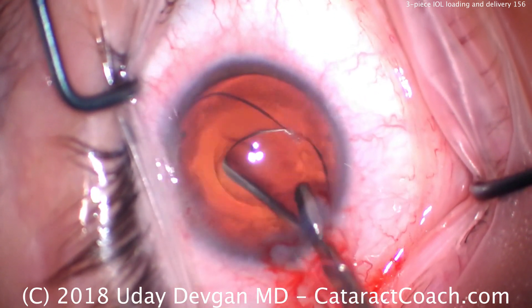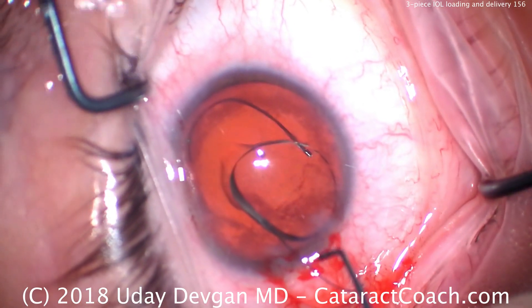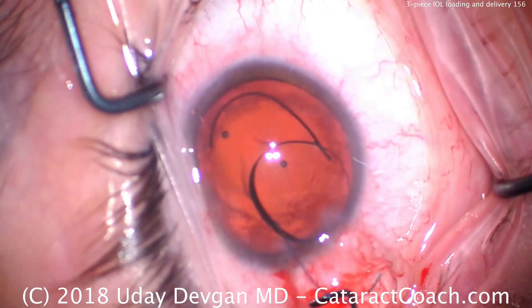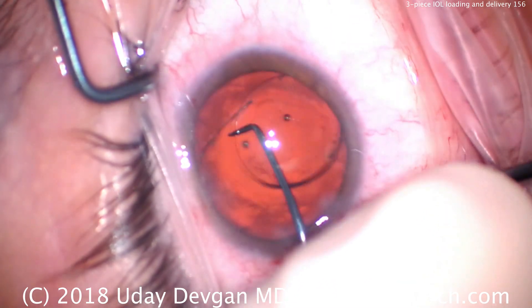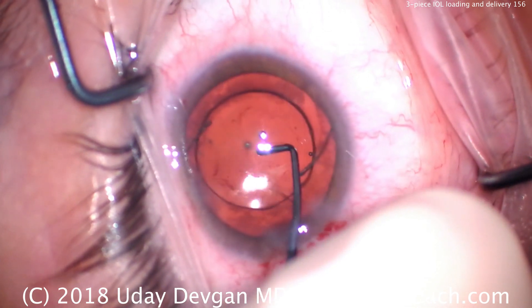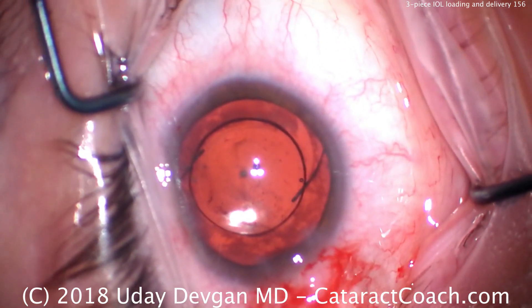We twist it to get the rest of the optic out, and now we can get the trailing haptic in as well. Importantly, we're confirming that the lens is in the eye correctly in the anti-S configuration. We can dial the haptics into the capsule bag just like that, and that looks great. Now let's do it again and watch what happens.